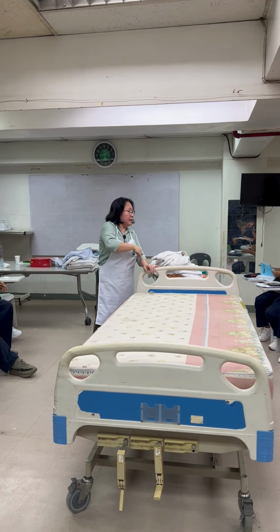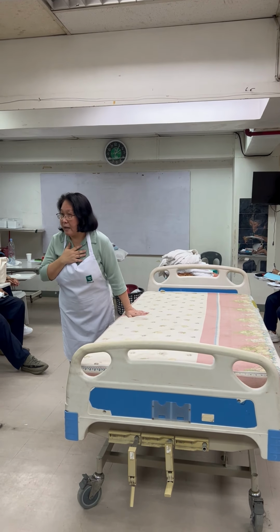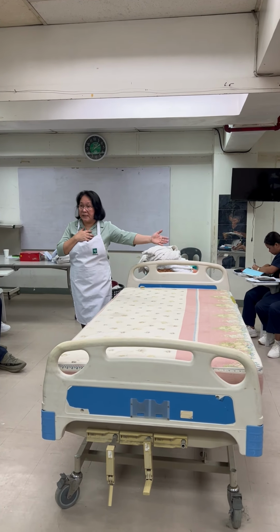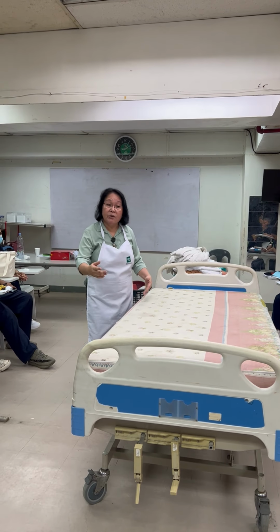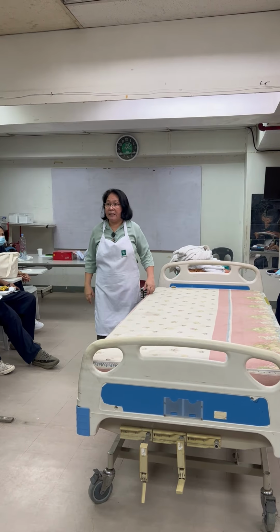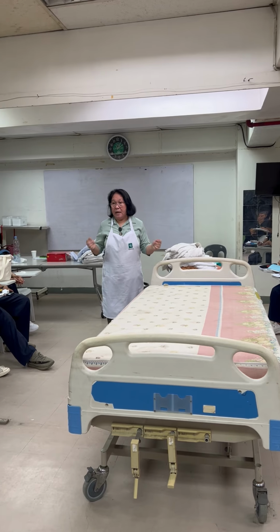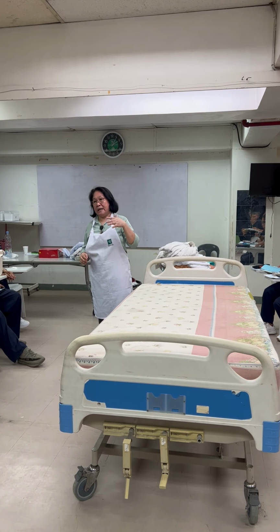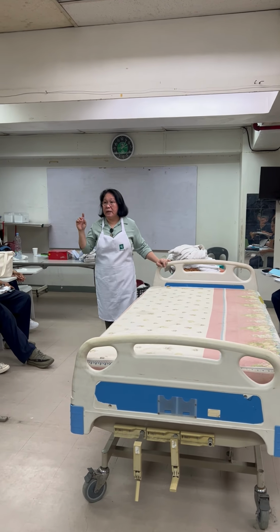What else? Safety. Okay, safety ni patient, safety nato nga healthcare provider. Safety ni patient, unsa man? Side rails up. Safety ni provider is you can PPE, proper body mechanics, at the same time you can elevate the bed to a comfortable working position. Okay? Para dili bubos dili sa taas. Comfortable working position.